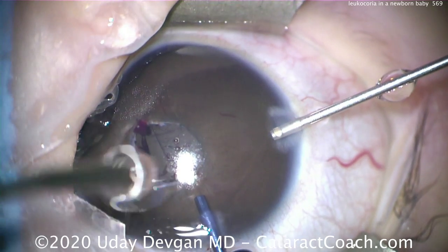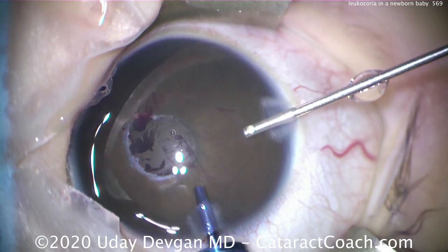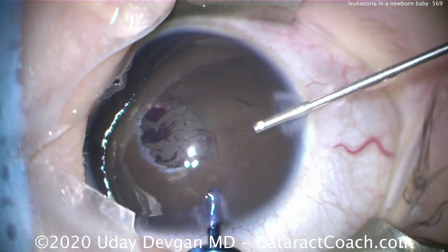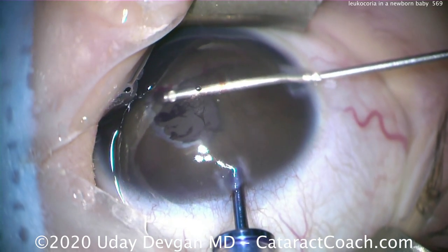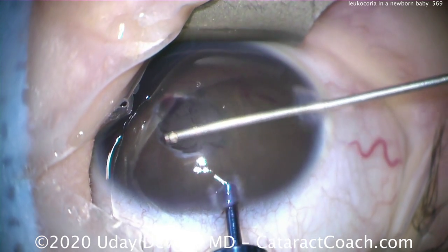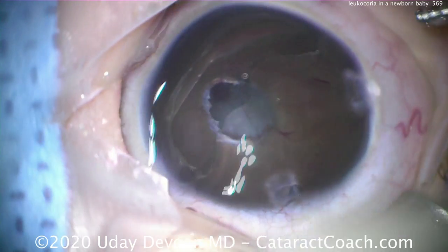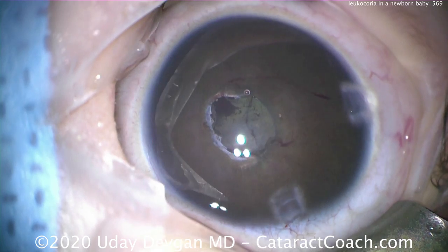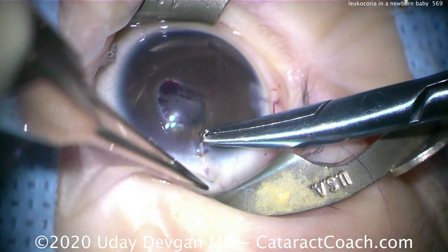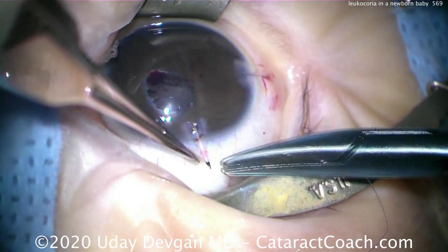At the end of the case, removing the viscoelastic from the eye very carefully, using a higher infusion setting in order to keep the anterior chamber deep. Don't go anywhere near the crystalline lens — the last thing you want to do is touch that lens capsule, because that will induce a cataract. We're very carefully removing the viscoelastic from the eye. We'll seal up the eye now and definitely put in sutures — in this case we're using 10-0 Vicryl, which are dissolvable sutures, and that'll be very helpful.